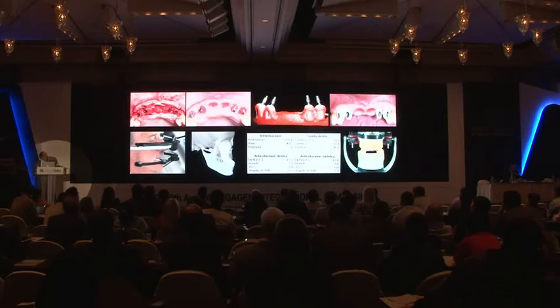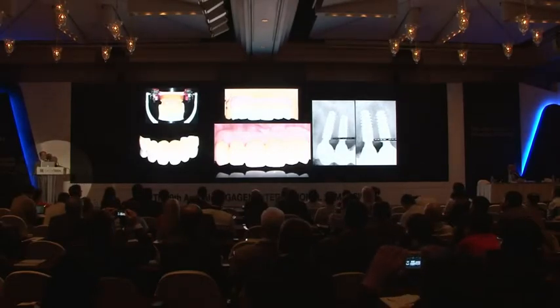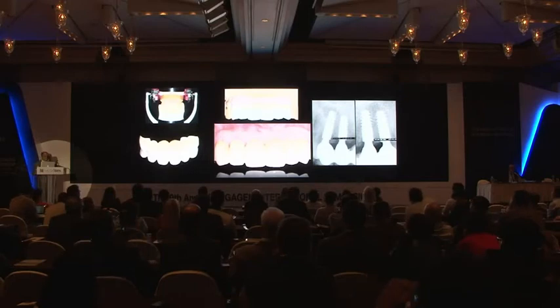At this point, in order to build a good occlusion on the patient, I'm having an electronic axiography to insert correctly the casts on the articulator and setting it by the values obtained. The final result, the RX control after 3 years, where we can see that even if we have a 2 millimeter distance, we don't have a crestal bone loss.